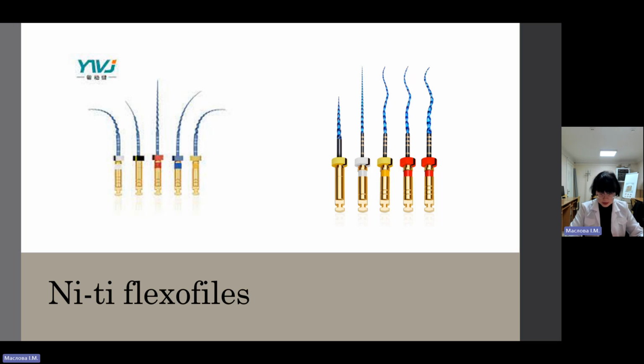This instrument is very useful when you want to provide instrumentation at the initial stage of root canal preparation.